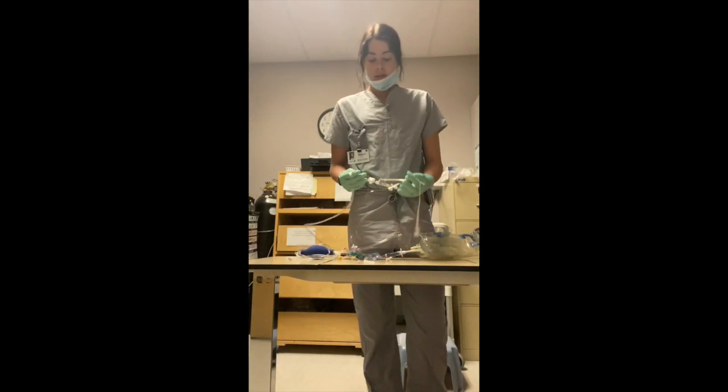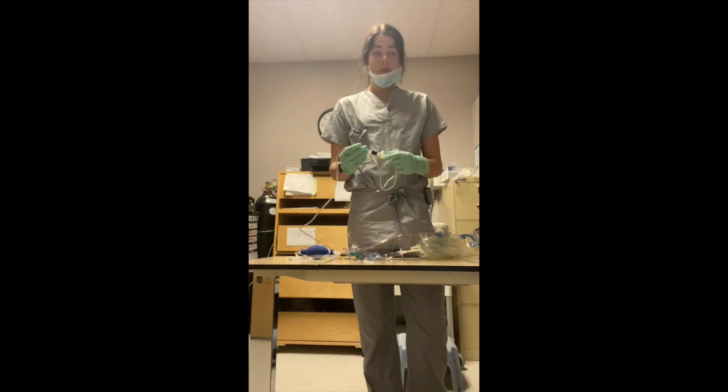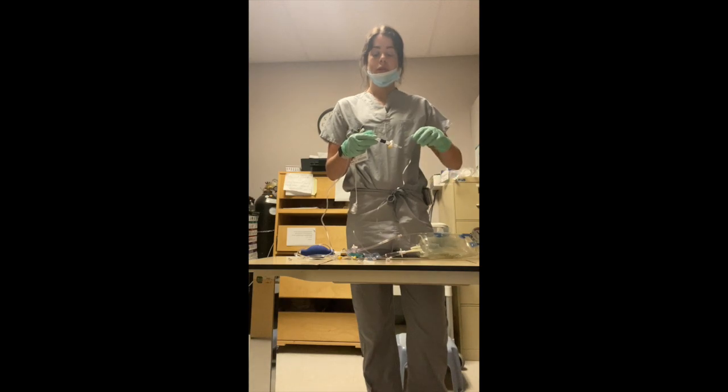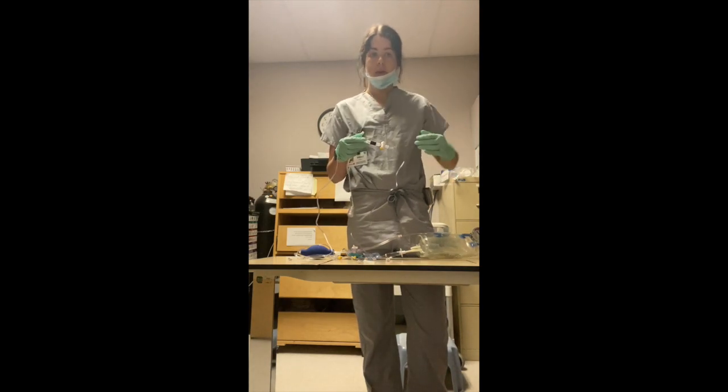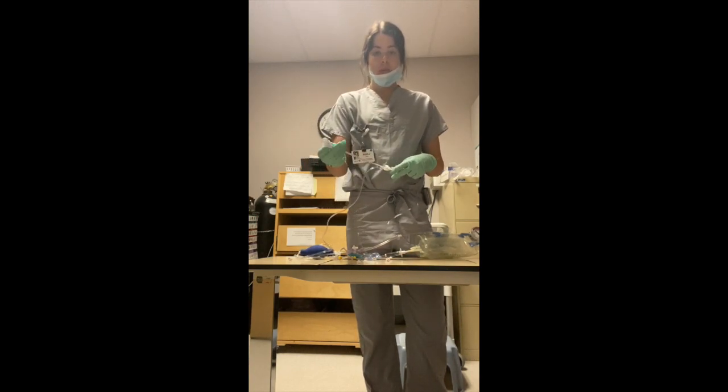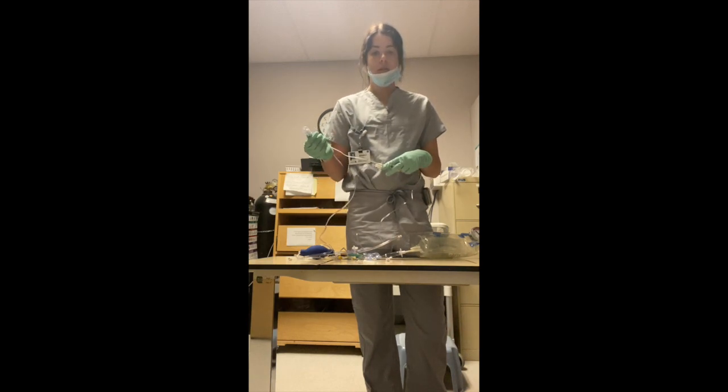So now that the line is all primed, we are ready to turn it to the patient. The transducer is placed on the patient at the phlebostatic axis, which is the level of the right atrium. Usually the patient's lying in the supine position, and this is about at the fourth intercostal space, in the mid-axillary line, where it's going to be leveled. And then this portion will connect to the transducer cable that connects to the monitor.